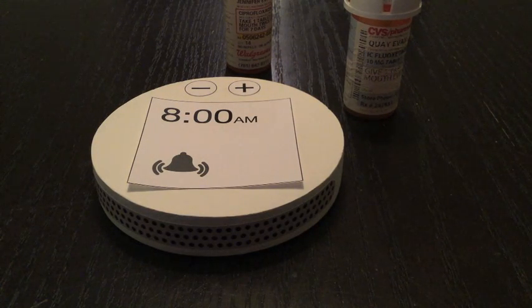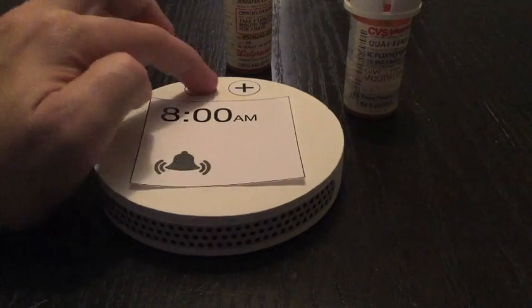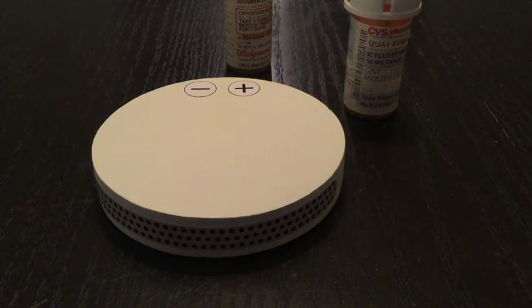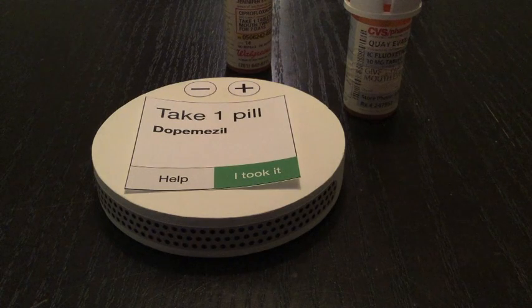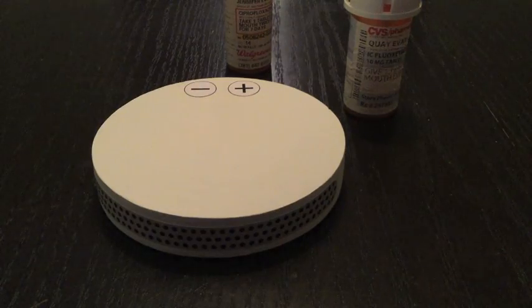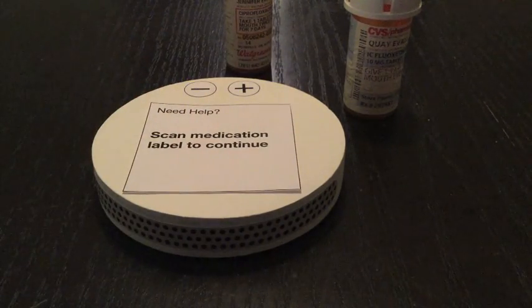An alert sounds, and the user can silence the alarm by either clicking on the screen or any of the controls on the device. The device then informs the user which medication is now due and the dosage. If they're unable to identify the correct medication or require further assistance, they click on the help key. The device then asks them to scan medication label to continue.